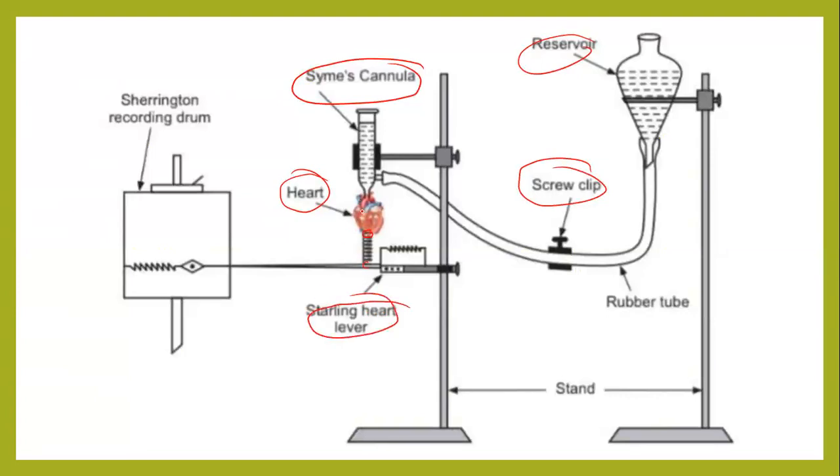So as this heart will be contracting and relaxing, we will get a recording on it. Continuous recording we will get.